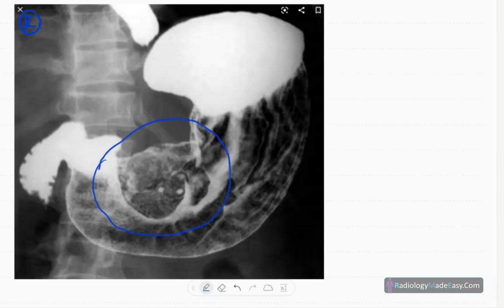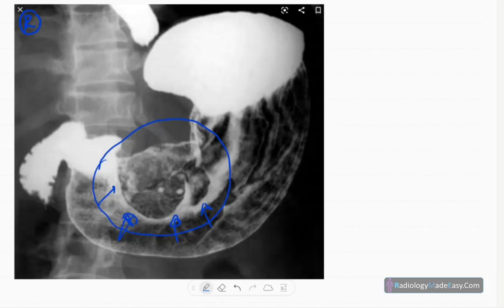Here you can see the margin of the filling defect, the partial filling defect in the lesser curvature of the stomach.